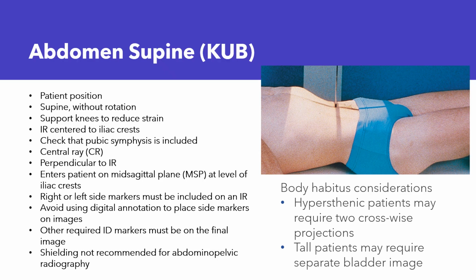Okay. We need all the bladder, both the ureters, and both kidneys. All right. So we start with the patient position. The patient needs to be supine. That means recumbent, laying down, with the anterior side facing up towards the ceiling. That is laying on their back.